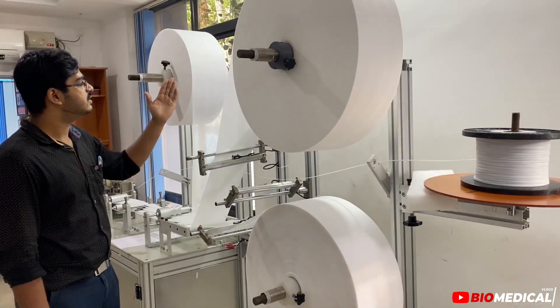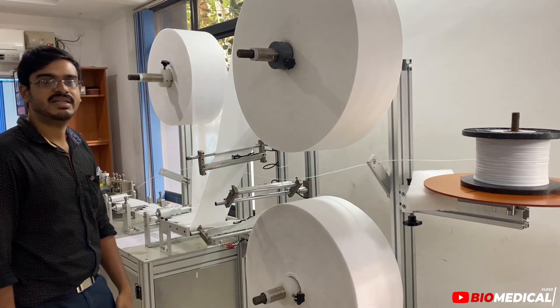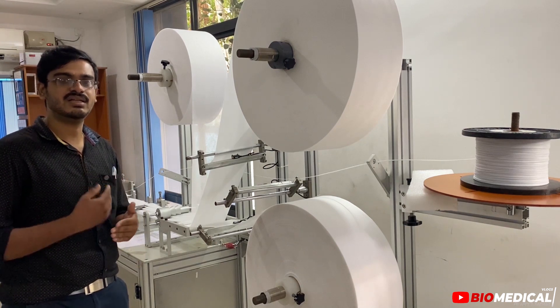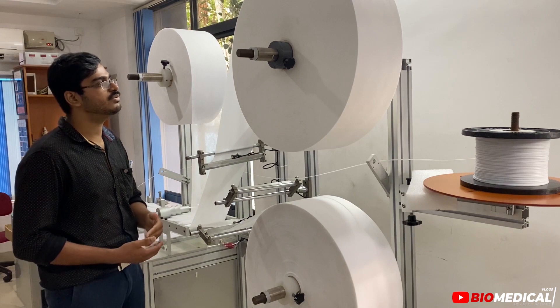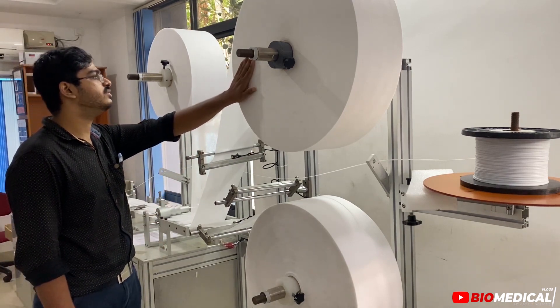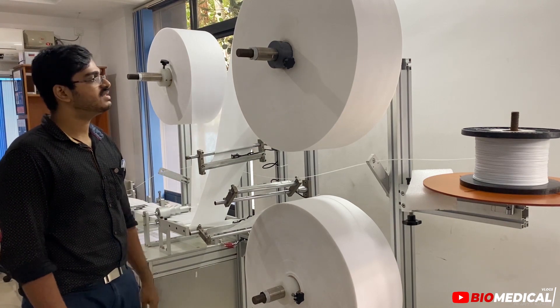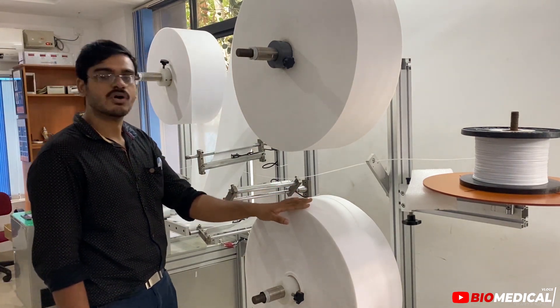The first layer is a non-woven material. The third layer is also a non-woven material.